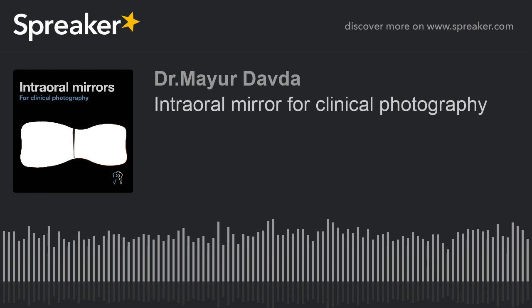What are the different criteria that make a mirror an ideal mirror for intraoral photography? Let us have a look. This primarily happens because one reflection is actually happening from the coating surface and the other reflection is happening from the thickness of the mirror. So you will get two reflections. I prefer the sides of the full arch occlusal mirrors to be convex because they will help me get an extra amount of retraction of the buccal mucosa.